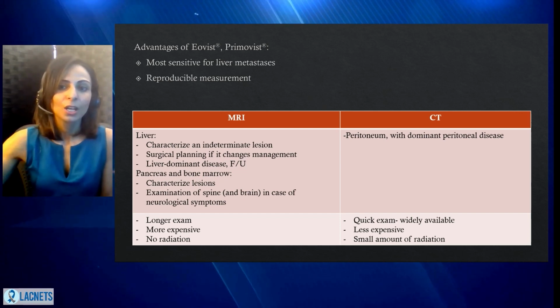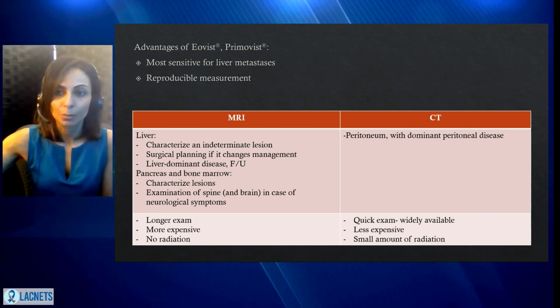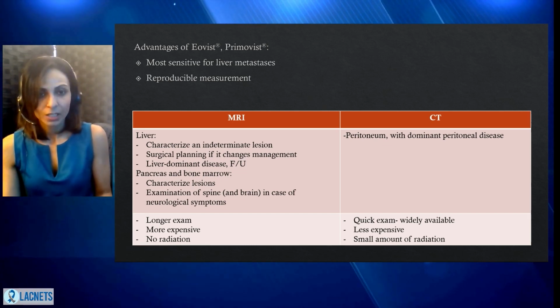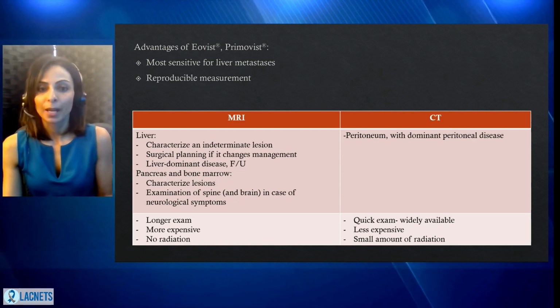But when we have younger people who are going to get a lot of scans over the period of their life, then it's good to be able to image them with MRI if possible and reduce the lifetime exposure to radiation. So now we get to PET.